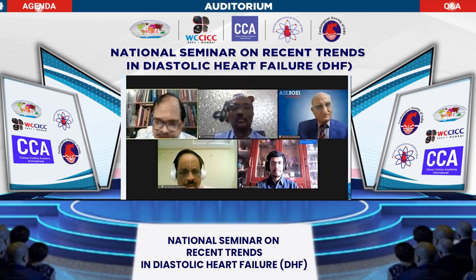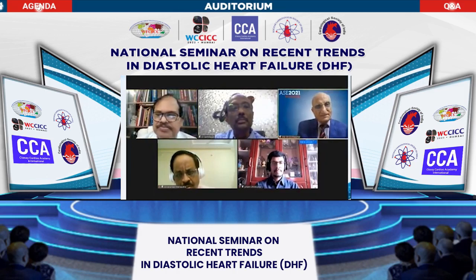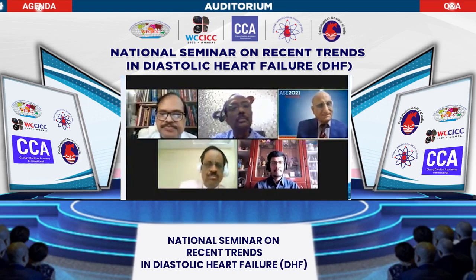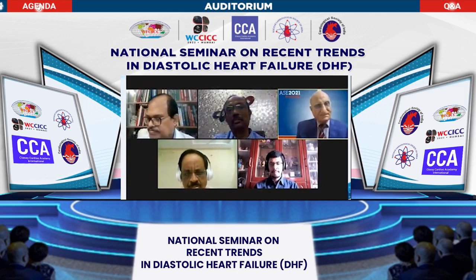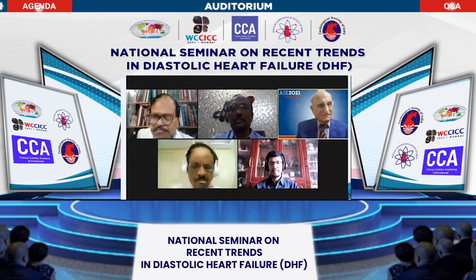Supposing the thickness of the pericardium is thin, but you have other diastolic features, what is the tip you can give us so that we will not miss it? A mere thickness is not the indication; we have to see constrictive physiology. A large number of patients may not show any thickness, but they still have constrictive pericarditis. Many of them may not show calcification, but there may be constrictive pericarditis.